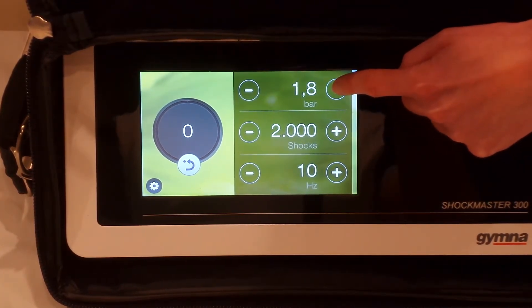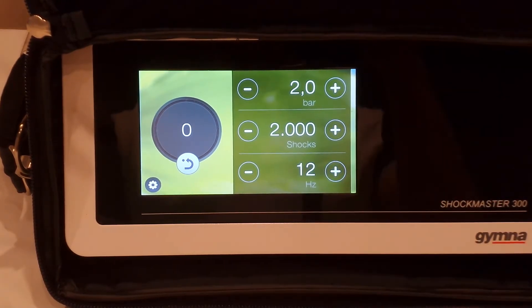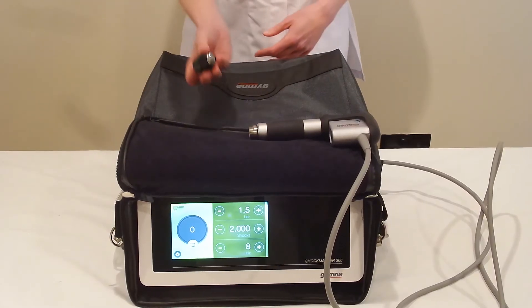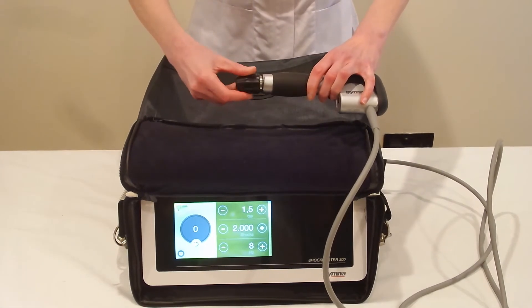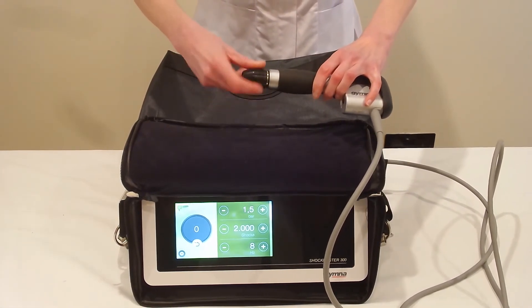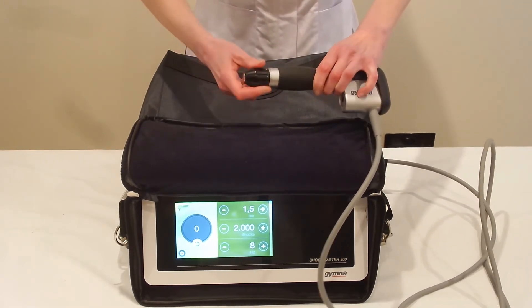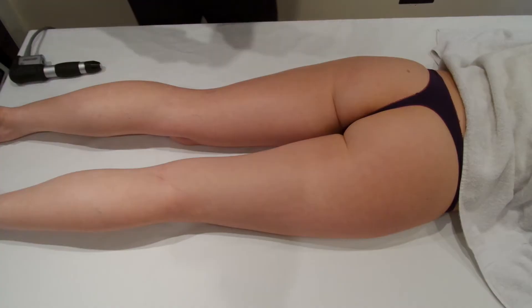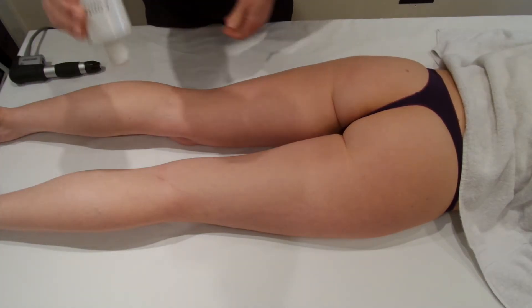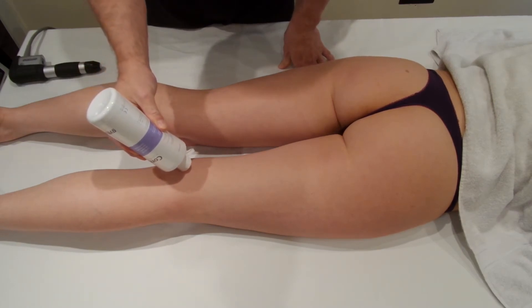Shockwave to the hamstring tendons to increase healing, done at lower pressure. We're going to go to 2 bar, 12 Hertz, using the 15 millimeter convex head, and we'll be treating the semimembranosus and semitendinosus. As you may have seen in the video to remove scar tissue, it's been done at a slightly higher frequency.